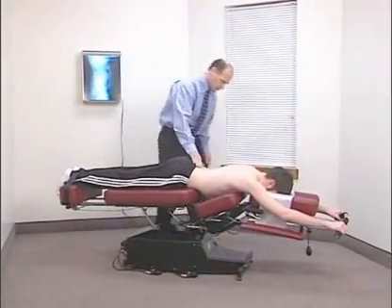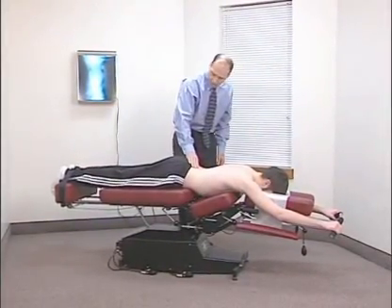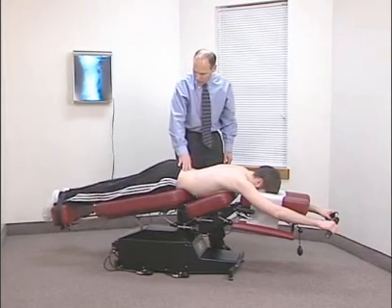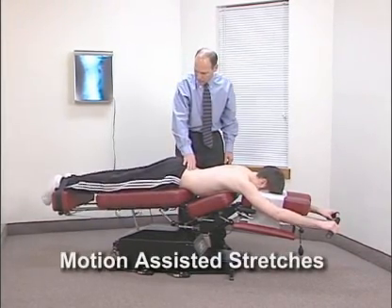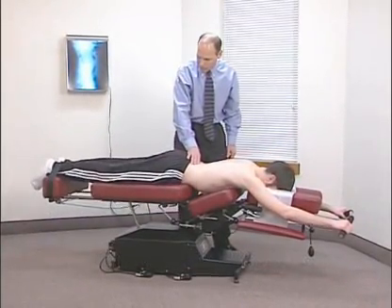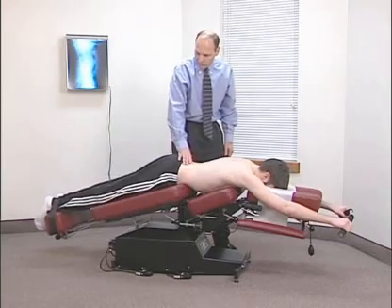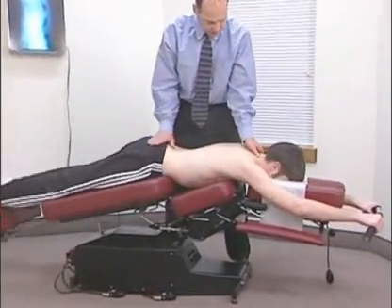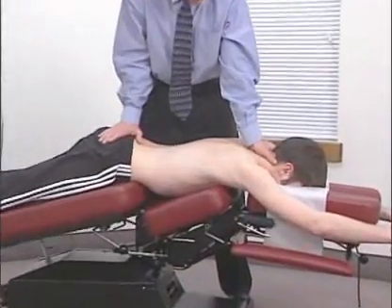After you have familiarized yourself with the table and you're comfortable placing the patient properly, you are now ready to apply therapeutic motion-assisted stretches. The use of motorized flexion distraction allows the practitioner the hands-free ability to stretch joints and muscle while in motion. These stretches are usually applied prior to the adjustment by the doctor or trained assistant.